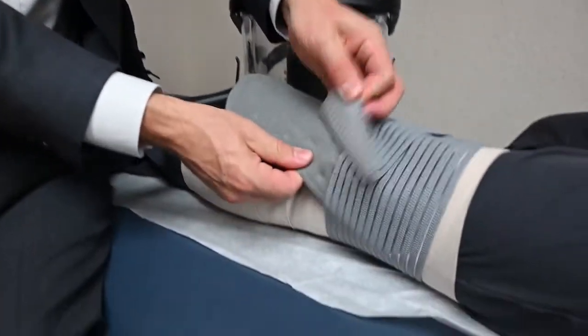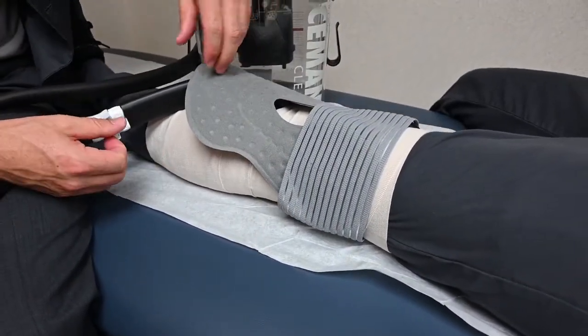You want to use the polar care for 20 minutes at a time for at least six times a day. That will help not only with pain but also with swelling of the knee. When you are done using the polar care, you simply remove it and place the brace back on the knee.